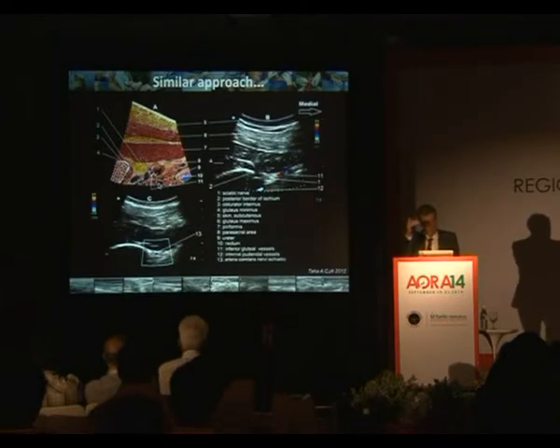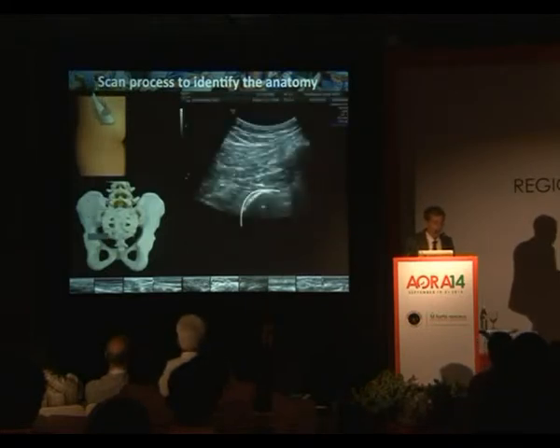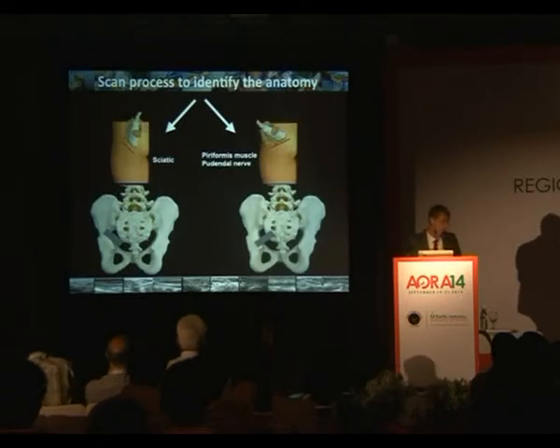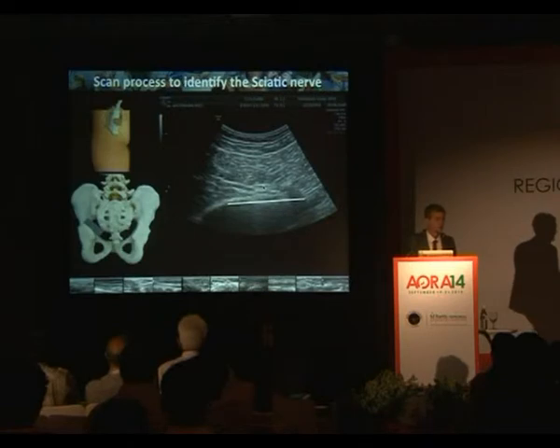You just have to go 2 centimeters lateral and caudally, and you will be, I think, much safer. In 2 words, you have the posterior superior iliac spine. One more time, you go down, you have that. As soon as you have the rupture of the line, you turn your probe laterally or medially, and you will have 2 options, and I think that's finished. You try to extend, you are here.